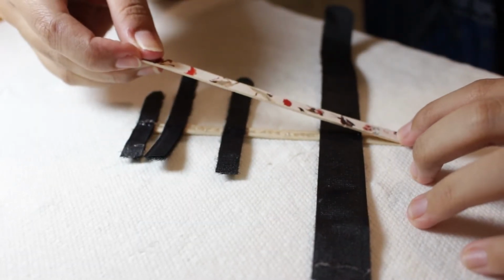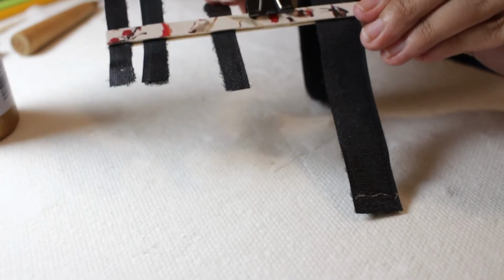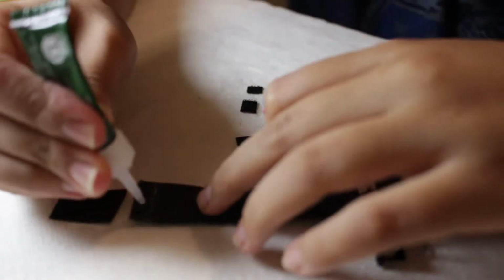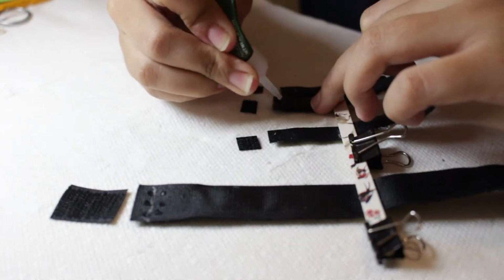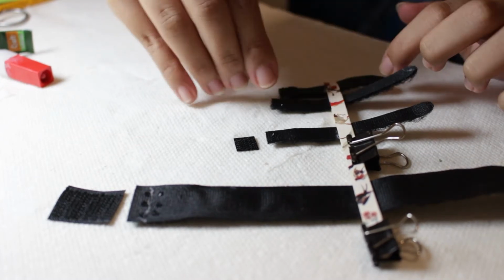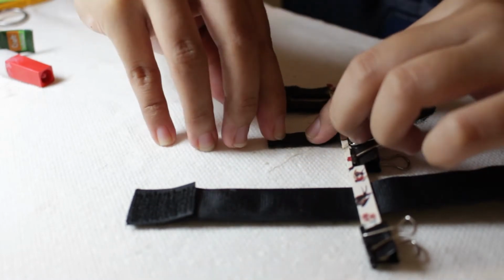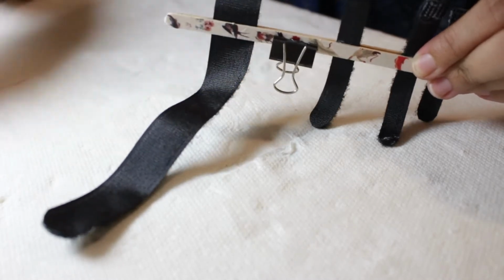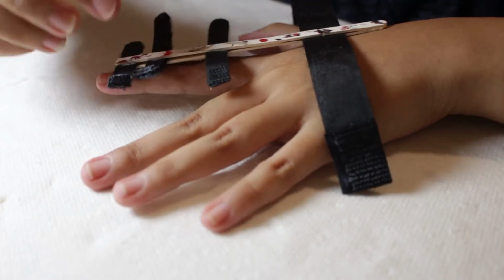Now glue the 2 popsicle sticks together with the Velcro in between. Here I'm placing clips on the popsicle sticks just to help the glue stick them together. Next, cut out 3 pieces of 1 cm by 1 cm rough Velcro for the 3 finger straps, and 0.75 inch by 0.75 inch rough Velcro for the mid palmar strap, and glue them flat side to flat side on one end of the soft Velcro. And when it's done, it's time to remove the clips and fit the splint on either finger.